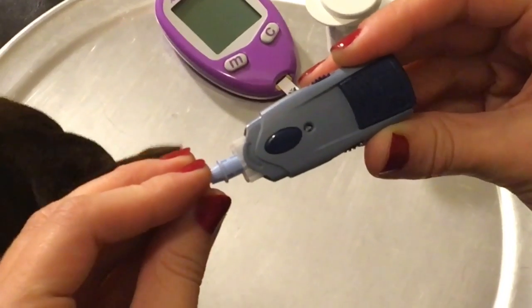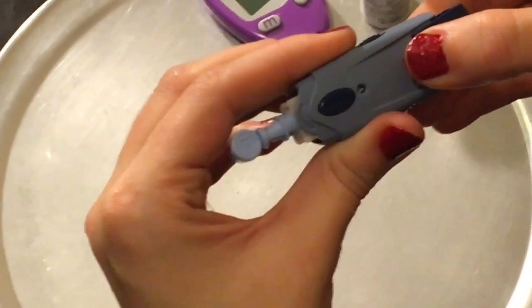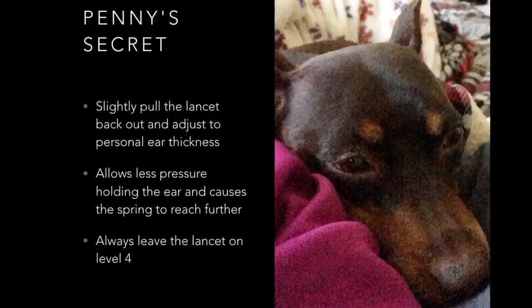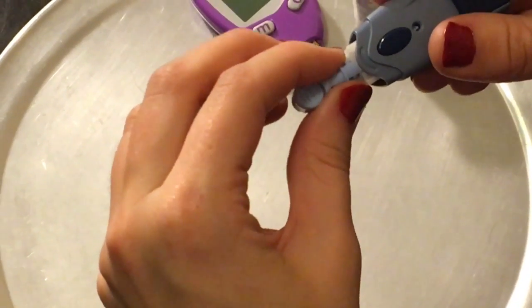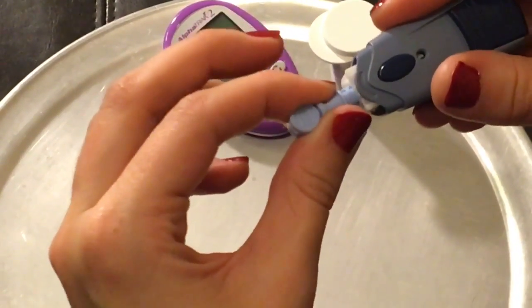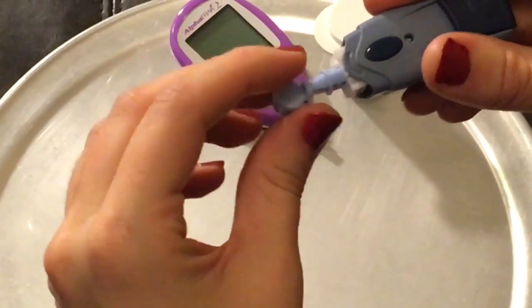You see that solid strip of plastic? That solid strip should line up with the button, and if you stick it into your meter and pull back the trigger, it should be in there pretty securely. Now Penny's secret is slightly pulling the lancet back out and adjusting it to her ear thickness. See how we push it in and slightly pull it back out. This trick allows us to get enough blood on the first try.